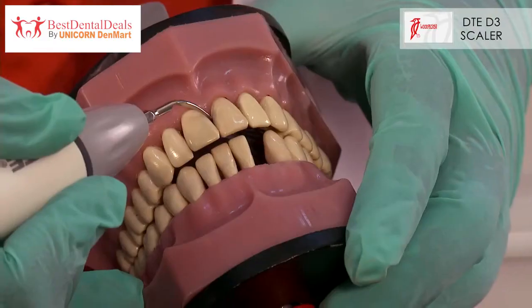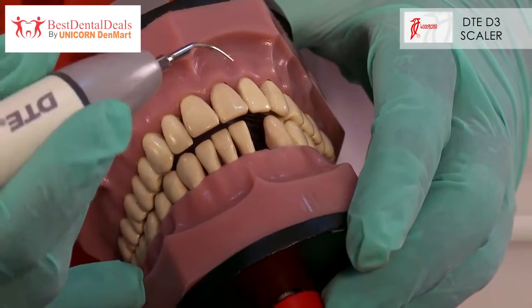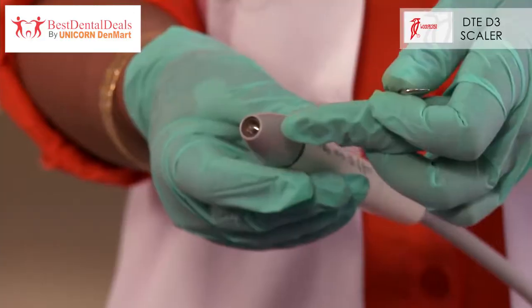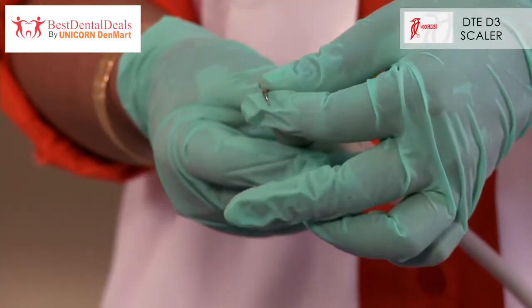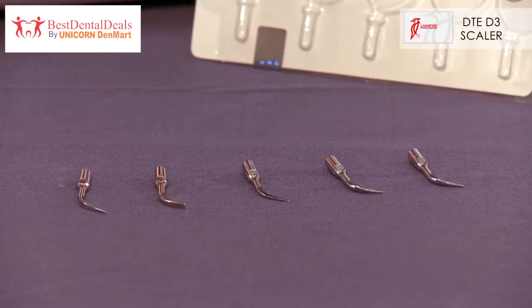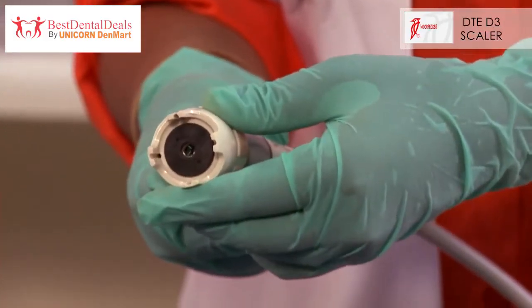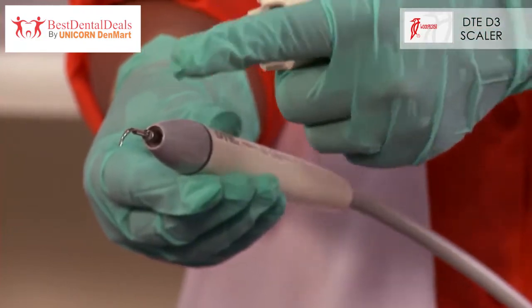This Piezon Scaler is effective in removal of plaque and calculus from various surfaces of the teeth. Used for removal of heavy stains and calculus, the DTE-D3 Ultrasonic Scaler treats different kinds of calculus with various kinds of tips available. Its autoclavable titanium handpiece, based on ergonomics and lightweight design, offers a firm grip and is easy on the wrist.